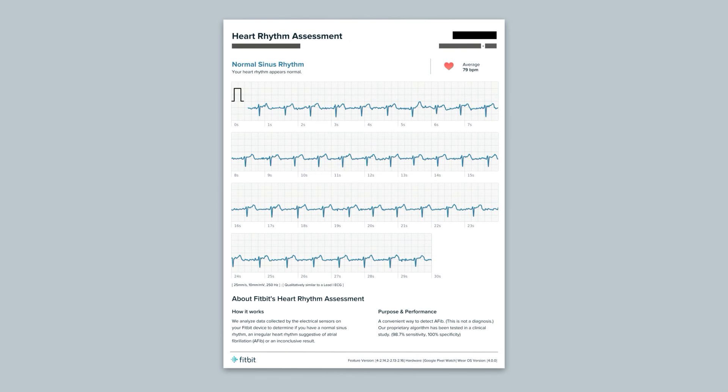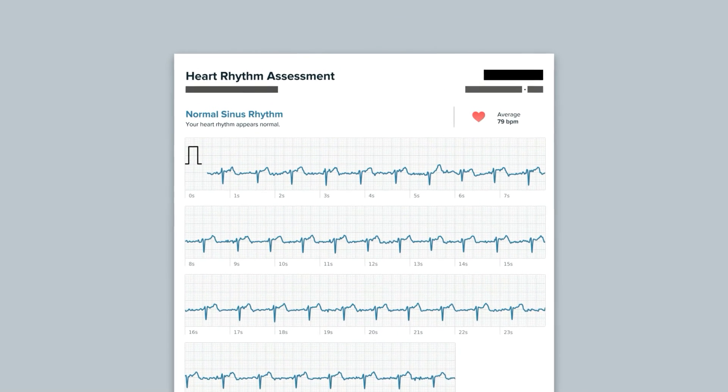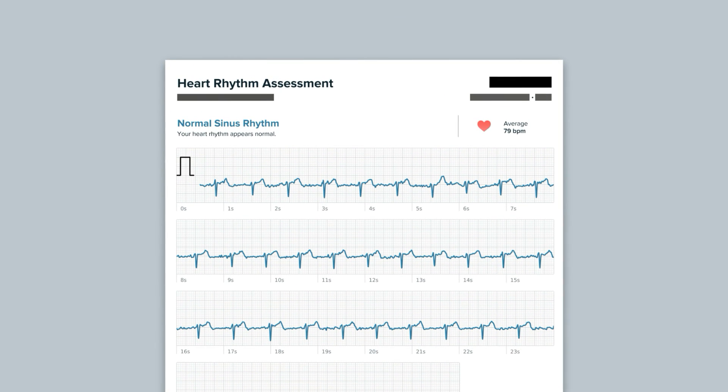The PDF report includes a more detailed graph of your sinus rhythm, as well as your ECG test results. Fitbit envisions this PDF report as something you could share with your doctor or other healthcare professional.